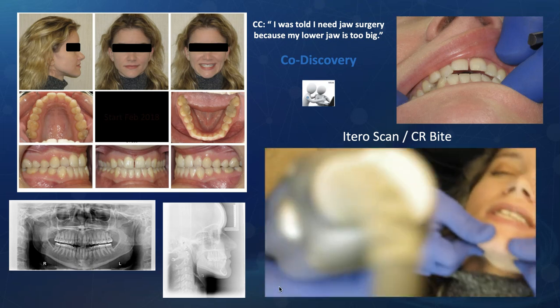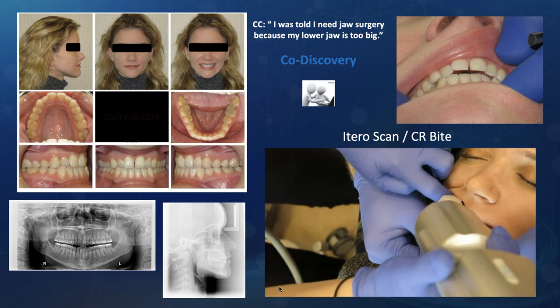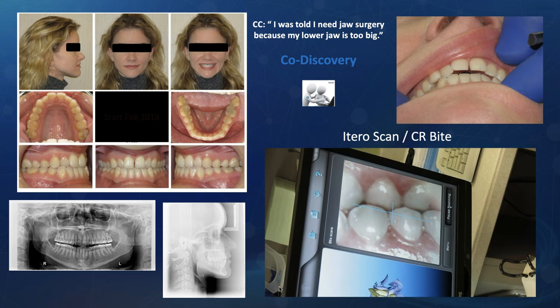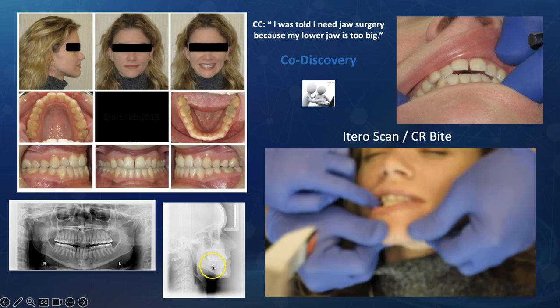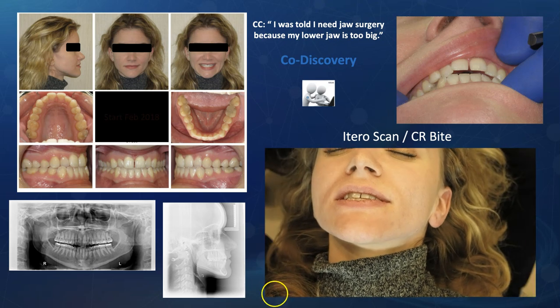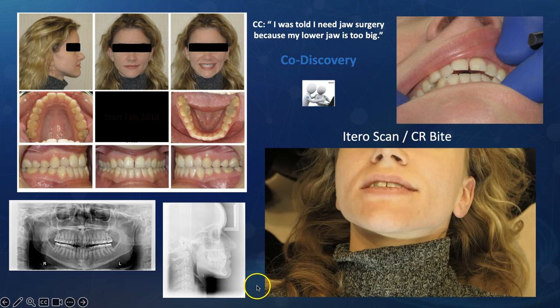And then the same thing on the other side. Okay, perfect. That should go. That's perfect. There, we got it.